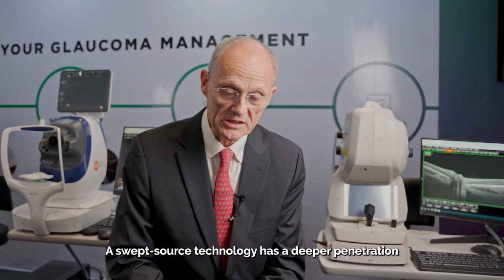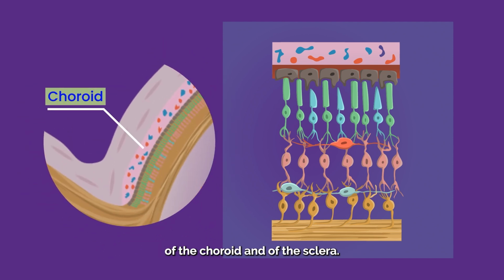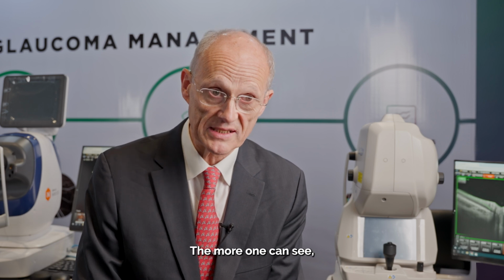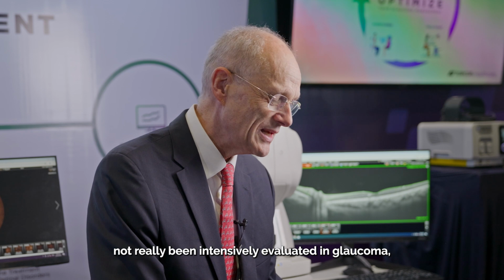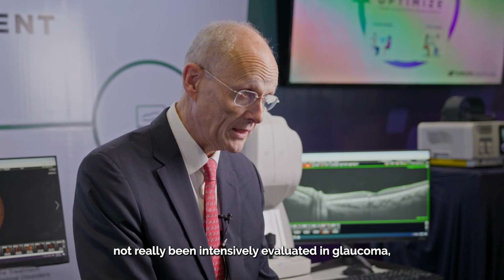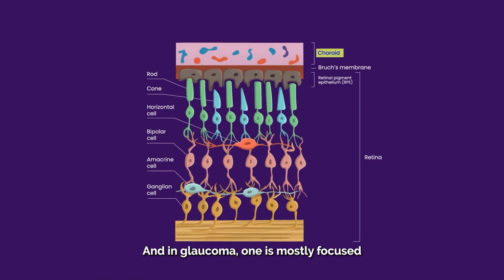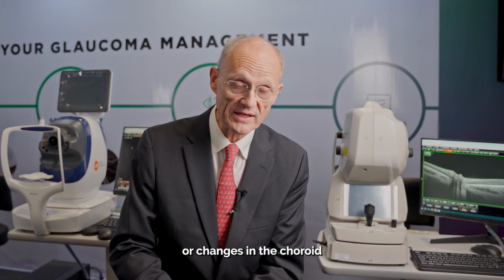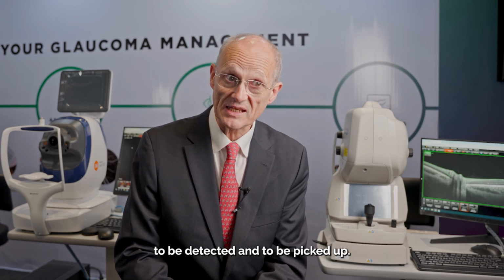Swept-source technology has a deeper penetration, so that it leads to a better visualization of the choroid and of the sclera. And that is generally, of course, of importance. The more one can see, the more one has a chance to detect. The choroid has so far not really been intensively evaluated in glaucoma, mostly also because one could not see it so well. And in glaucoma, one is mostly focused on the inner retinal layer, the ganglion cell layer. And glaucoma also has primary or secondary defects or changes in the choroid, which are definitely very interesting to be detected and to be picked up.